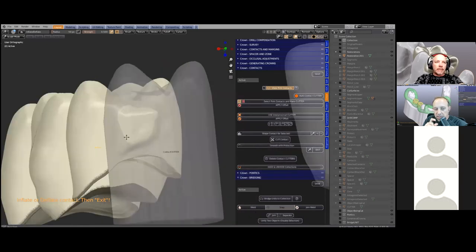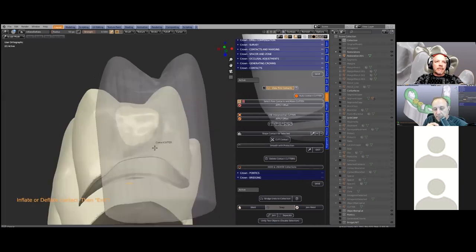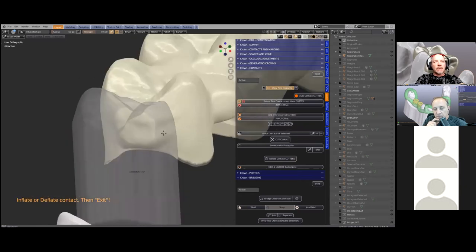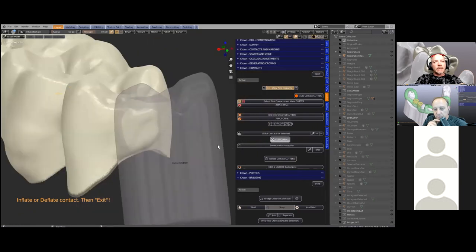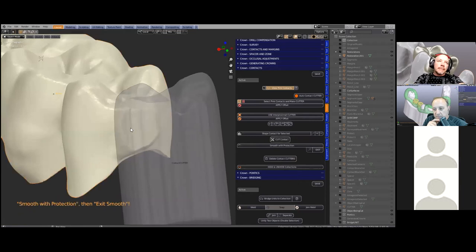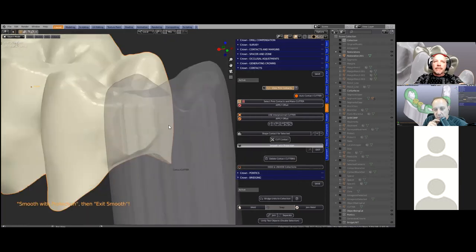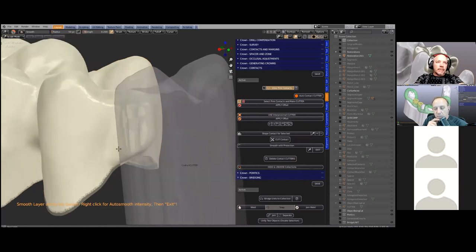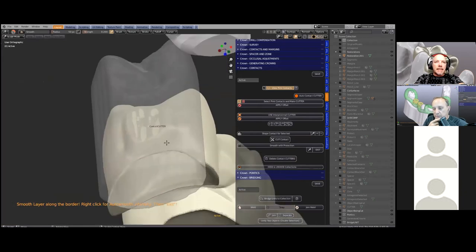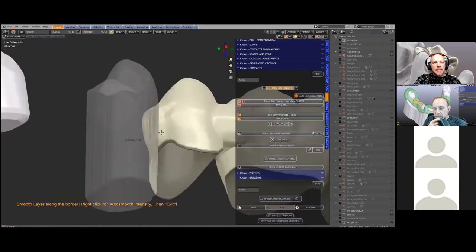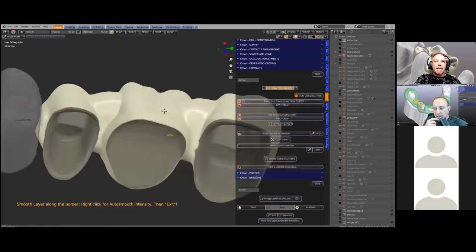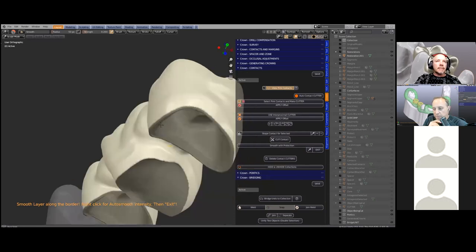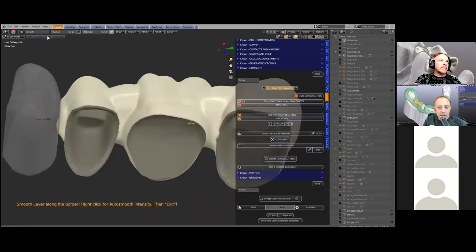This means we can give the case a really nice broad contact to prevent any food traps. You can push or pull the mesh in and out, keeping in mind that the fitting surface is still protected — no matter what you're doing to the outside, you're not going to distort the crown. By pressing 'cut,' the contact point is cut out, and all that needs to be done is smooth it down a little bit. Contacts are very important; for adjacent crowns the path of insertions are determined through the initial surveying of the yellow surfaces.